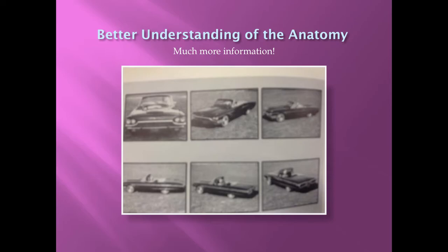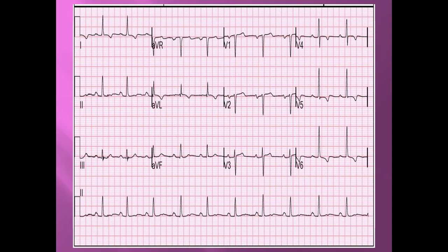So monitoring this cardiac electrical activity from 6 angles gives us a much greater perspective. And this is an example of what would be printed out from the ECG, and it's what we must interpret to determine the functionality of the heart. The ones that you have a bit more information, and I think we know the basics of this already.